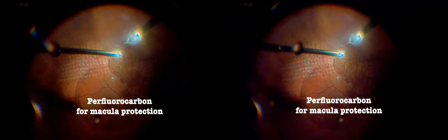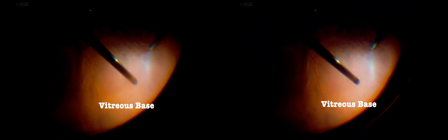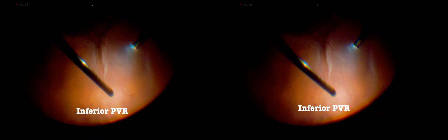Perfluorocarbon liquid was injected to protect the macula, preventing detachment from extending into the macular area. Its weight and surface tension mechanically stabilized the retina, preventing further detachment. The vitreous base was carefully approached from superior to inferior, removing all potential vitreous fiber attachments, enhancing the mobility and flexibility of the retina.